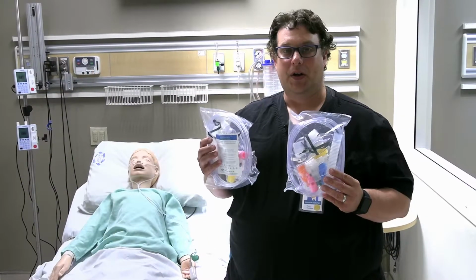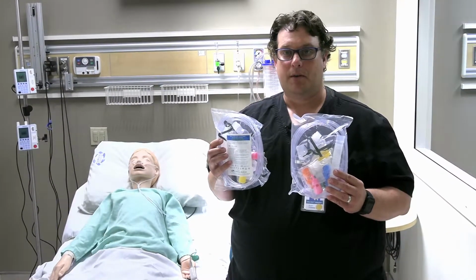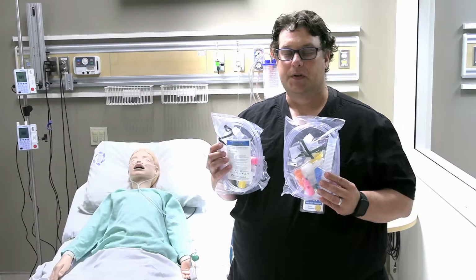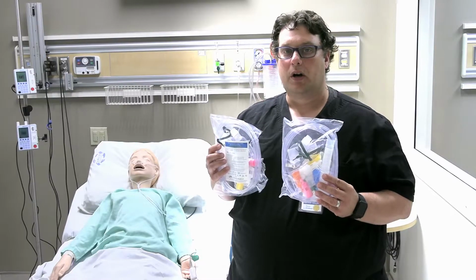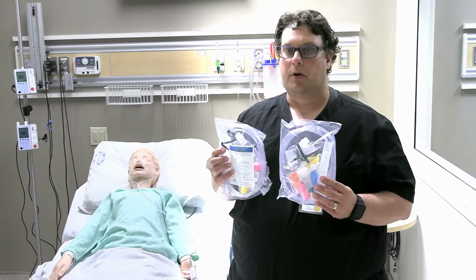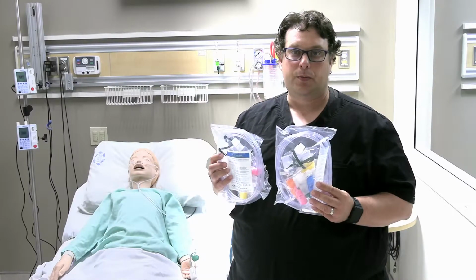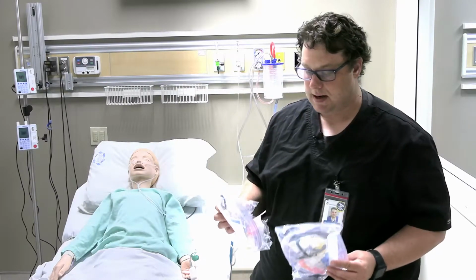We have both adult and pediatric Venturi masks available to us here. If you only have adult Venturi masks available to you at your organization, that will work perfectly fine for you. Just the mask itself may be a little bit too big for the patient involved at the time.